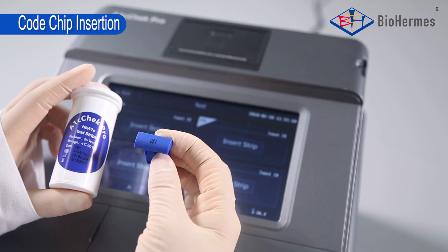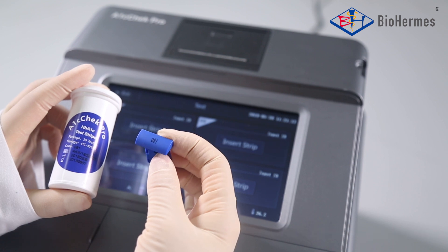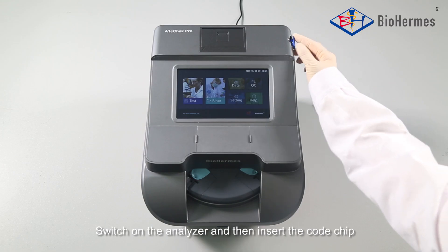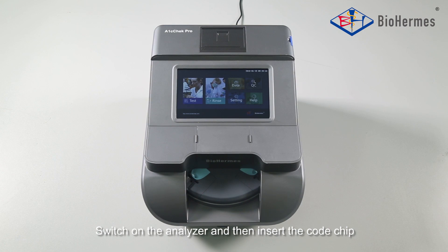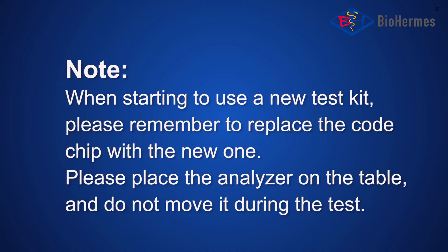Code Chip Insertion: Make sure the code number on the code chip matches with that on the test strip vial. When starting to use a new test kit, please remember to replace the code chip with the new one.